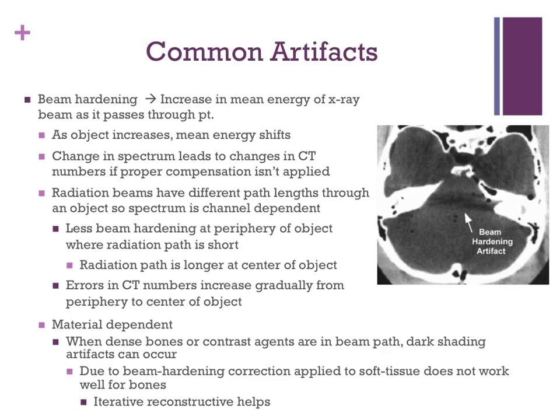object. Beam hardening effect is material dependent, so when dense bones or contrast agents are in the beam path, dark shading artifacts can occur because the beam hardening correction applied to soft tissue does not work well for bones. To combat this, iterative reconstruction helps.